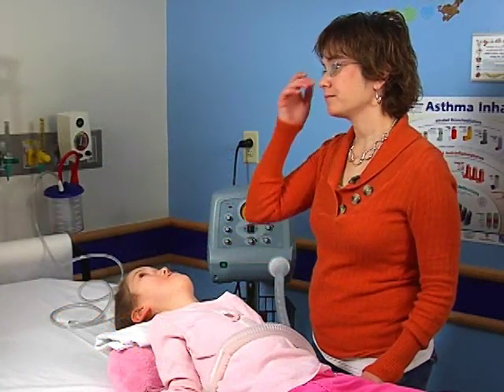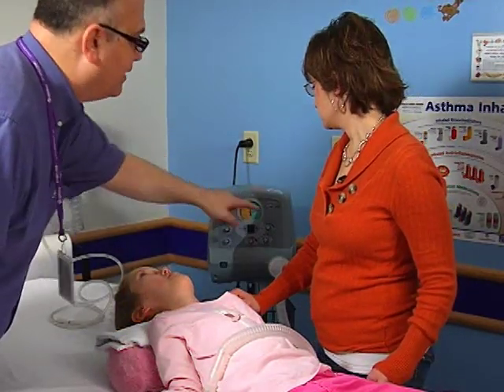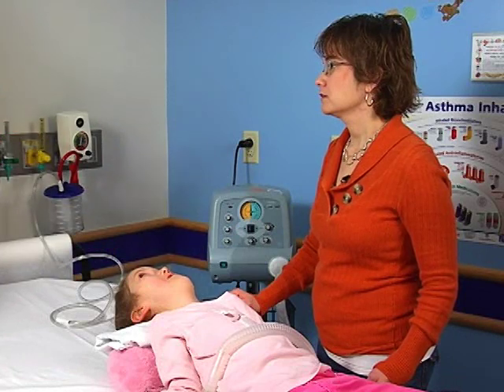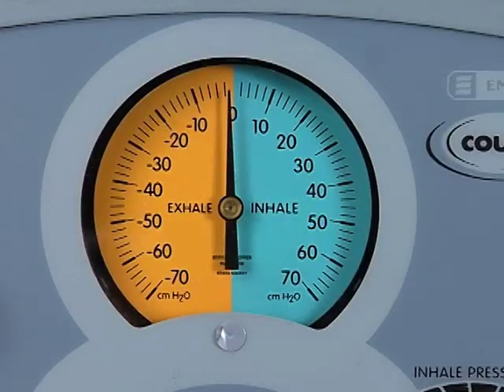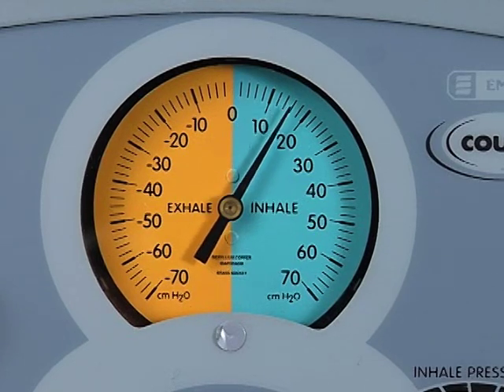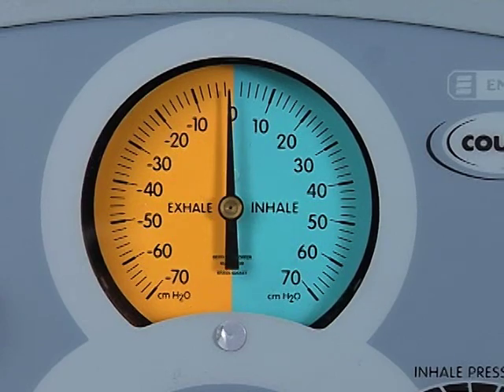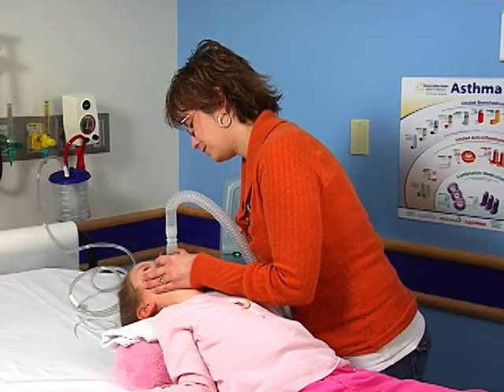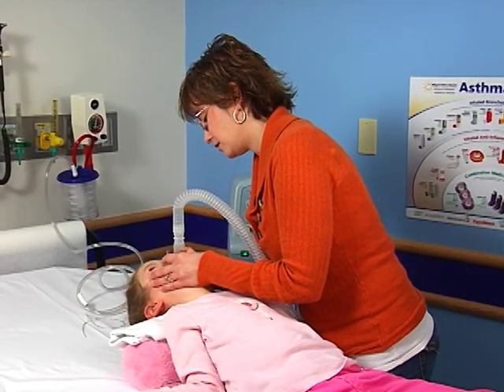Your respiratory therapist will help you during the start of setup by making sure that you understand the machine and are comfortable with making any changes on it. You will start out with low pressures and gradually reach the maximum amount of pressure that you can tolerate during each phase of your breathing. In the beginning, the time for each phase of breathing will be set to your comfort level by the therapist.